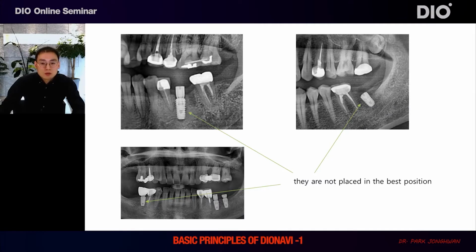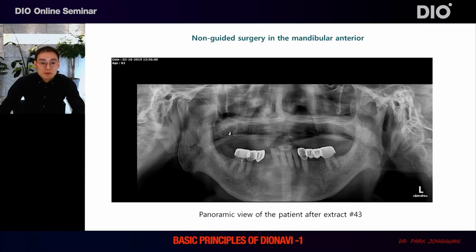Even recently, I've been placing them by hand sometimes. Of course, most of the time I use DIO, but there are times when you do it by hand. There were some cases where the location was not as good. It's because it was pushed by hand. I've chosen a few cases related to bad positioning in the last 2 years or so.